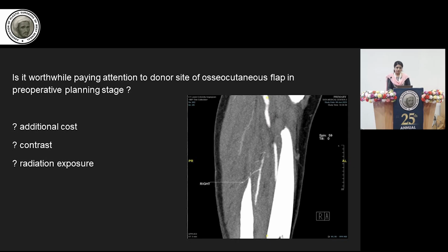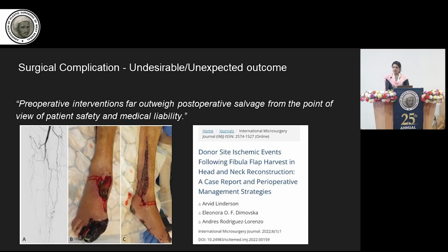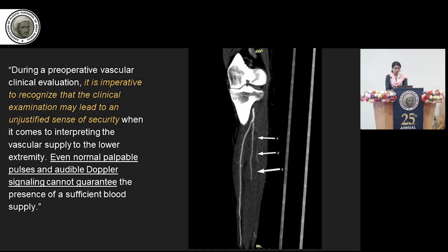So is it worthwhile paying attention to the donor site of an osseocutaneous flap during the pre-op planning stage? You're subjecting the patient to extra contrast, extra radiation, extra 3,000 rupees, extra 4,000 rupees, another trip to the radiology department. Is it really worth it? There is enough literature published indicating case reports where surgical complications, as Adisha mentioned yesterday, undesirable, unexpected outcomes leading to a delay in patient recovery have occurred. Preoperative interventions far outweigh post-operative salvage from the point of view of patient safety and medical liability.